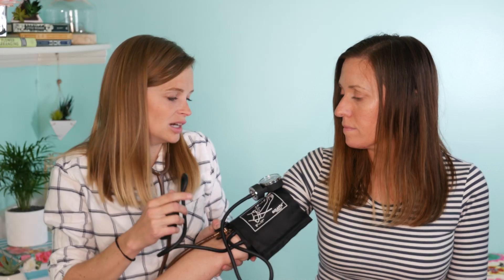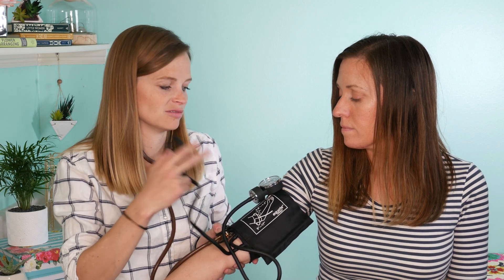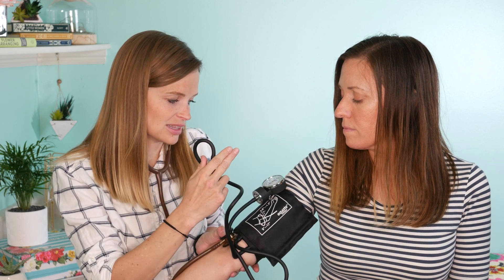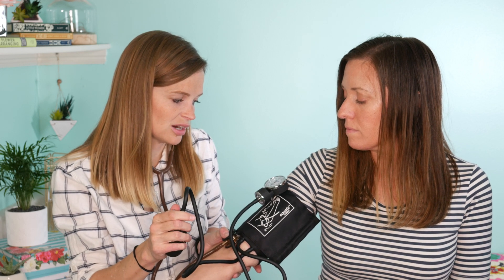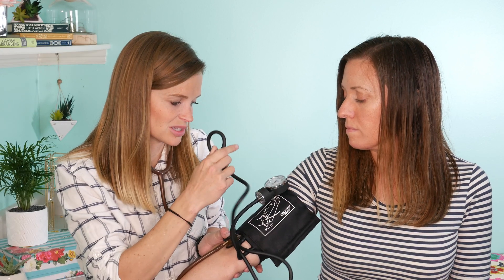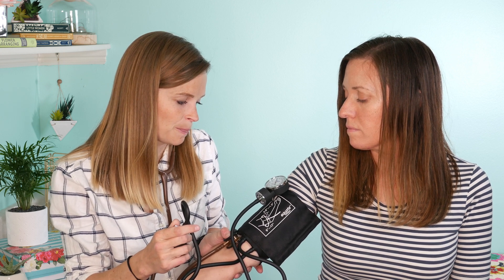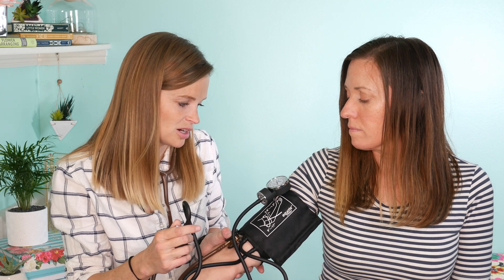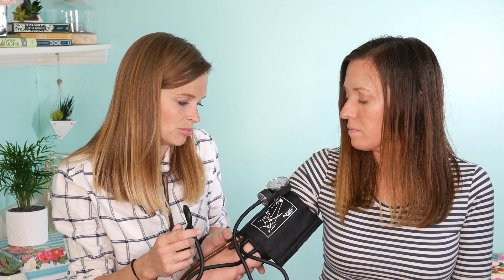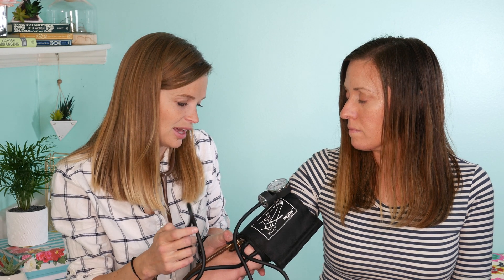Then I'll inflate the cuff. If you know they have high blood pressure you might need to inflate it a little higher. A textbook normal blood pressure is 120 over 80, so I like to inflate it to about 160 and gradually decrease it. You squeeze the air pump so it fills up, gets tight on their arm, then you gradually let the air out. Watch the gauge and listen — when you can hear their pulse through the stethoscope and the needle starts to bounce, that's the top number. When you stop hearing the pulse, that's the bottom number. That was 110 over 70 for her.